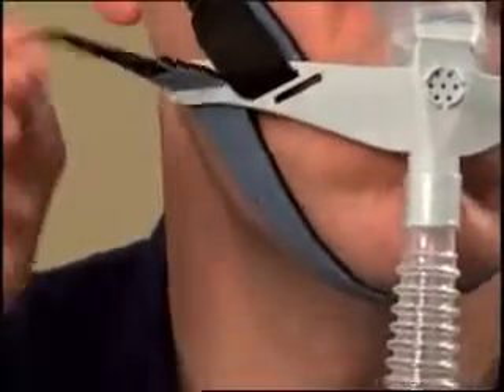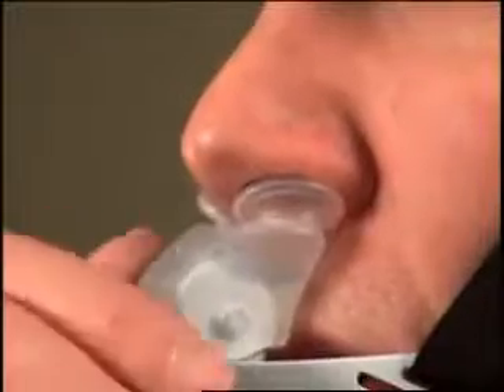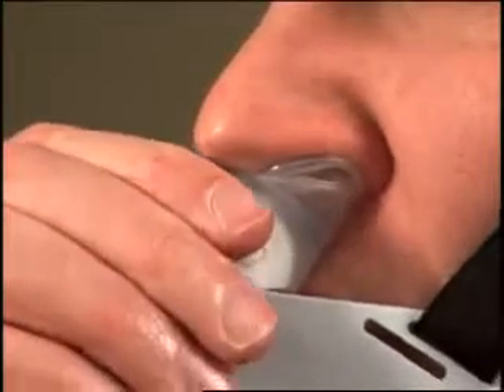Verify that the chin support band is not over-tightened. Move the headgear side straps to the front slots on the interface. Rotate the cushion for better placement in the nostrils.